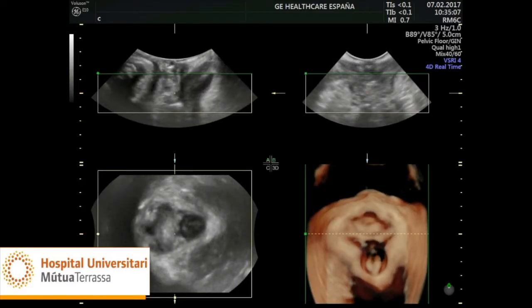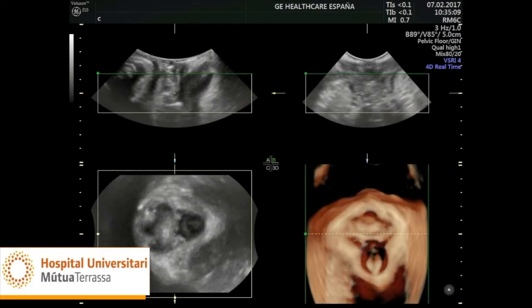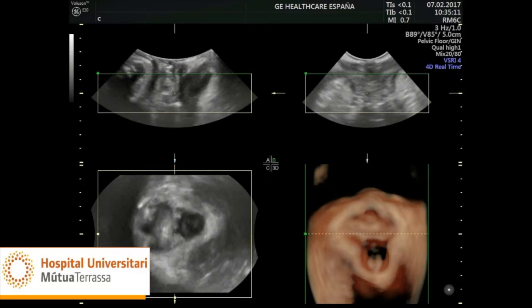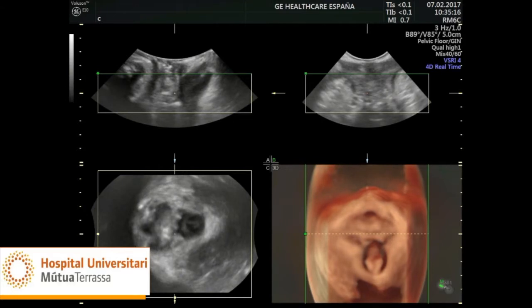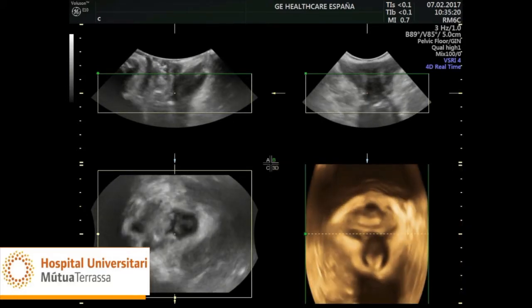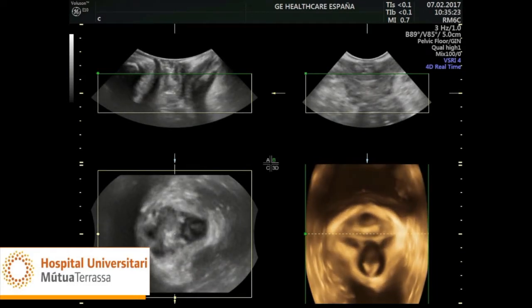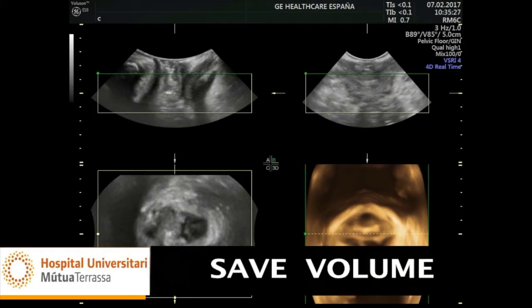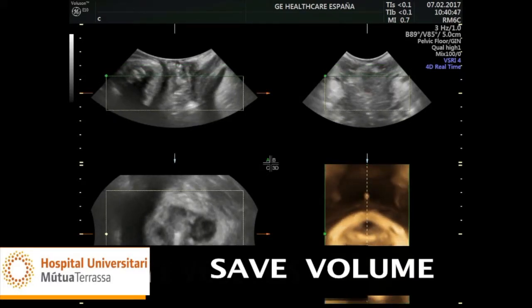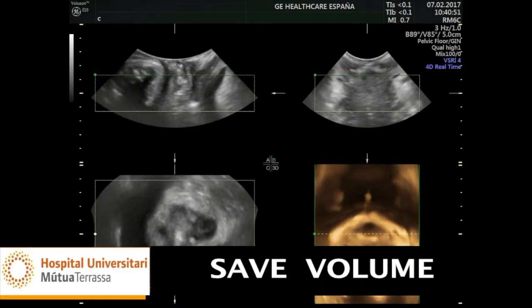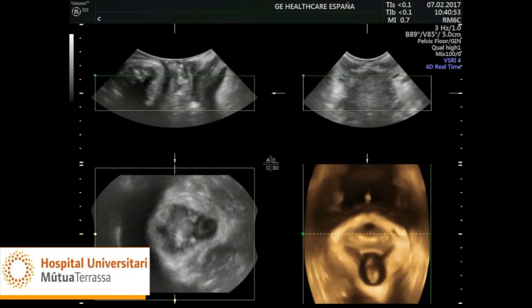The three-dimensional image can also be improved by combining different reconstruction modes — surface, smoothness, minimum, maximum — depending on the patient's characteristics and the operator's preferences. At this point, the patient is asked to fully contract the pelvic floor muscles when we save the sequence. This sequence is formed of multiple volumes that can be assessed. We usually analyze the volume that has the maximum contraction. The same procedure is followed for the capture of the Valsalva manoeuvre.